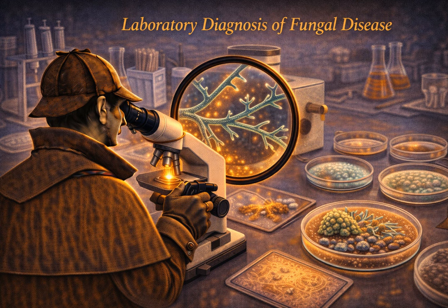So you grind the tissue, you plate it, and nothing grows. Nothing grows. The lab officially reports no fungal growth. The clinician reads that and thinks, oh good, it's not Mucor. Maybe it's a weird bacterial infection. They stop the empirical antifungals, and the patient dies from an untreated fungal invasion. That is chilling. So the physical act of processing the specimen can literally kill the diagnosis if you don't understand the underlying biology. Correct. This is exactly why clinical communication is key.